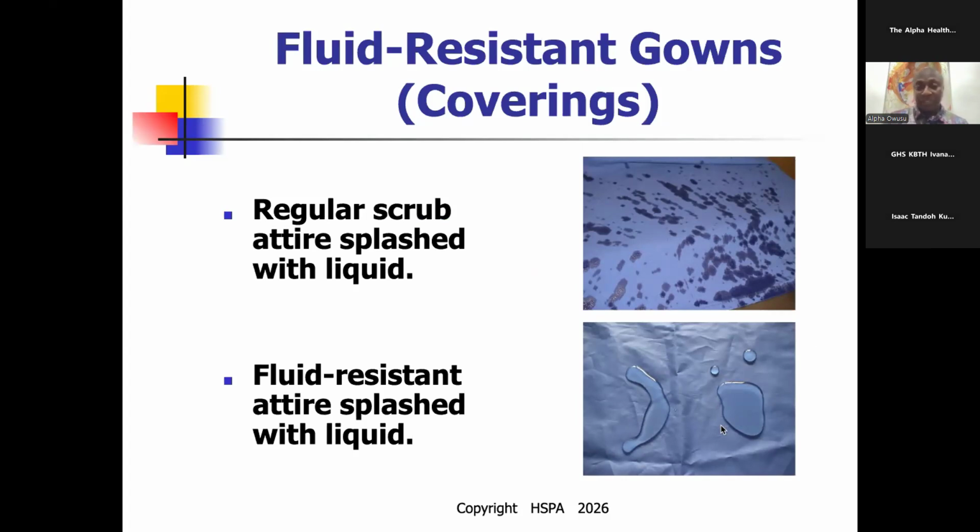Because somebody can work in decon, get this splash on their attire or scrubs, and then go to the prep and pack area, carrying that infection from the decontamination area, and then prep instruments. And I strongly believe, because I've seen it, when I was doing assessments in these hospitals, you see the person moving from the decontamination area and going to the operating room with the water and everything all over the place. Very important here: the right supplies, the right consumables.